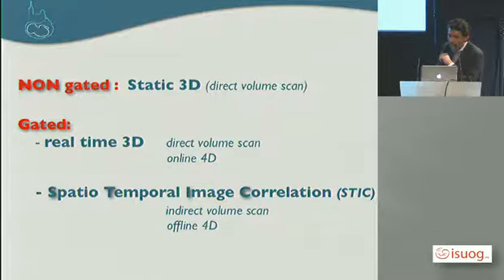When we speak about this topic, the main goal is to try to improve the pickup rates of congenital heart disease. Why? Because the fetal heart is a very complex anatomical structure. The baby is moving, the heart is moving, and the heart anatomy is very difficult to assess. So the main goal was initially to improve the detection rate of congenital heart disease with this technique, by decreasing the dependency on the skilled operator using 2D ultrasound.